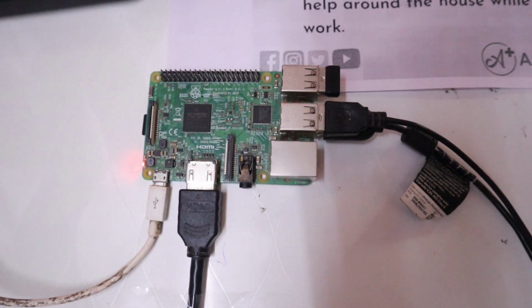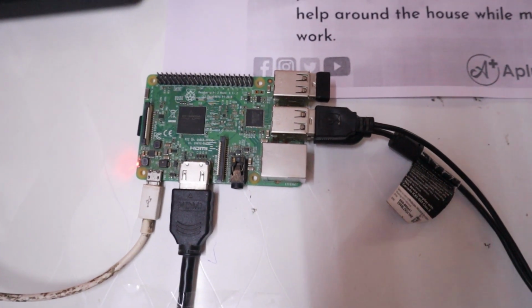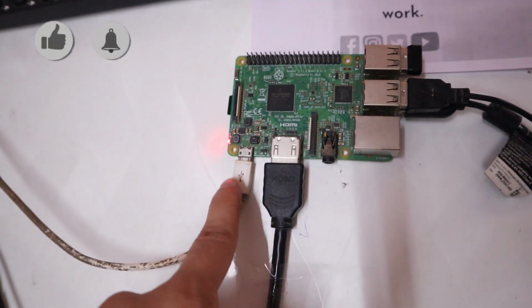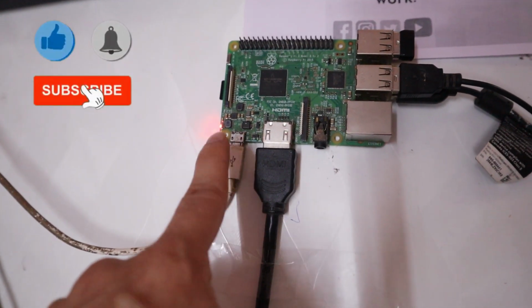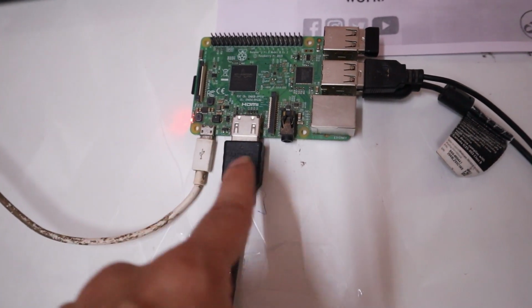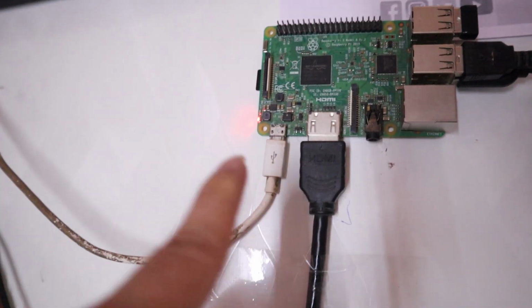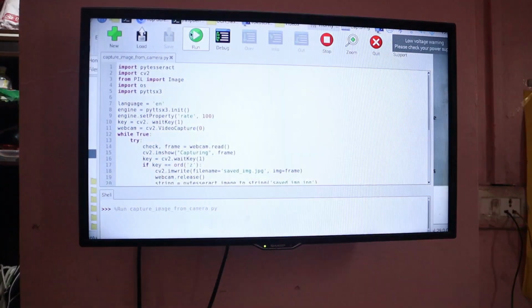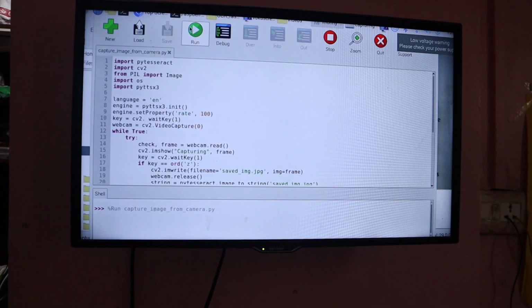Okay, now we will see the practical demonstration. You can see in the hardware part we have the Raspberry Pi. Then we have given power supply to the Raspberry Pi through this pin. This is nothing but a 5 volt 2 ampere adapter power pin, which is connected from here to here on the Raspberry Pi, this white pin. Second, we have an HDMI connector which is coming from our screen. You can see this is my screen. You can use any screen which has an HDMI port.